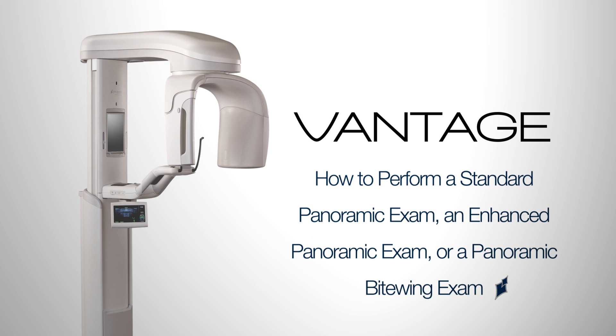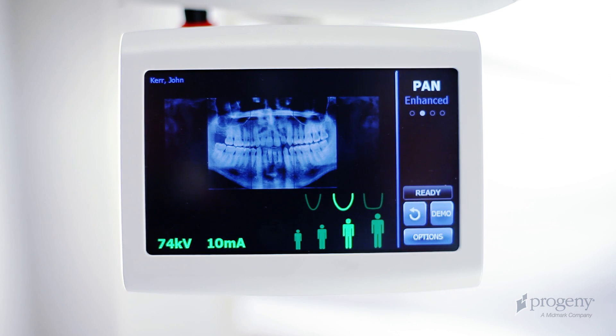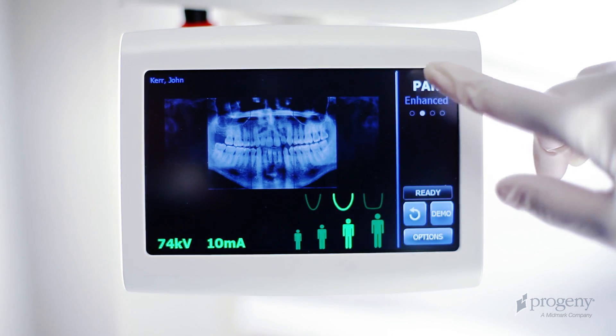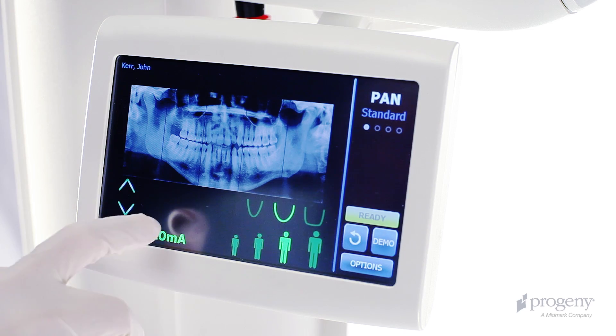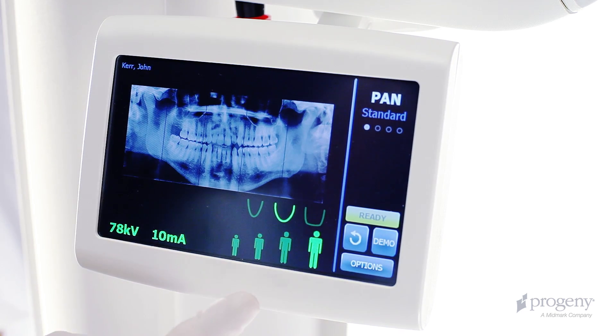How to perform a standard panoramic exam, an enhanced panoramic exam, or a panoramic bite wing exam. Choose a procedure by tapping the Vantage Touch control panel. Verify your technique according to patient size and anatomy.